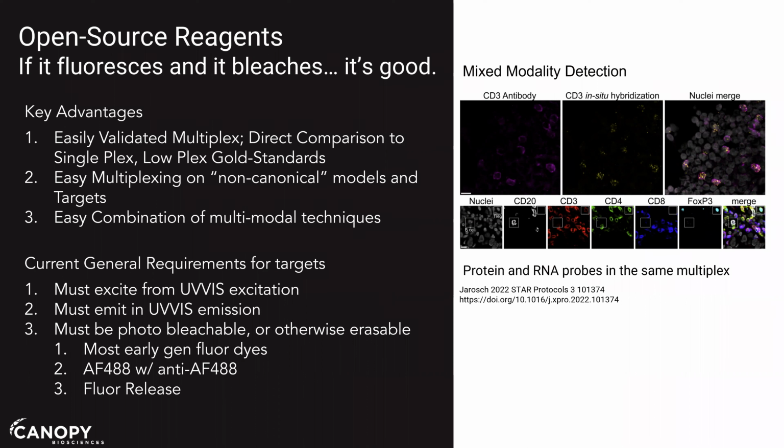If that cytokine is intercellular, it's just going to be kind of everywhere. Which is fine, but if you're trying to assign it to particular cells, which is really the work most people are trying to do with spatial biology in general, it's almost impossible to do that. But what you can do is take a look at the RNA that's actually being expressed and tie that directly to particular cells. So when you have a marker that doesn't necessarily have an antibody that makes sense, or the localization doesn't make sense, that's when you can combine it with RNA signals and have something really, really powerful.